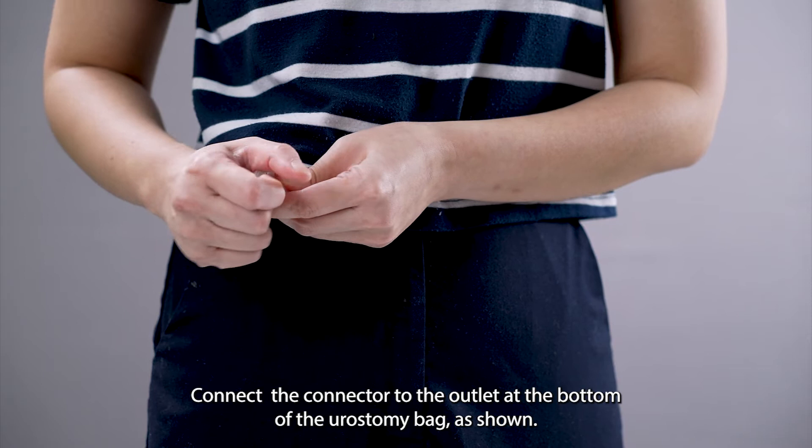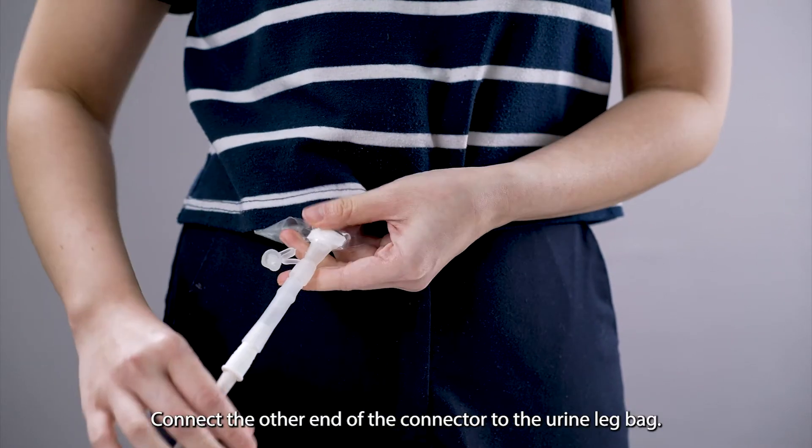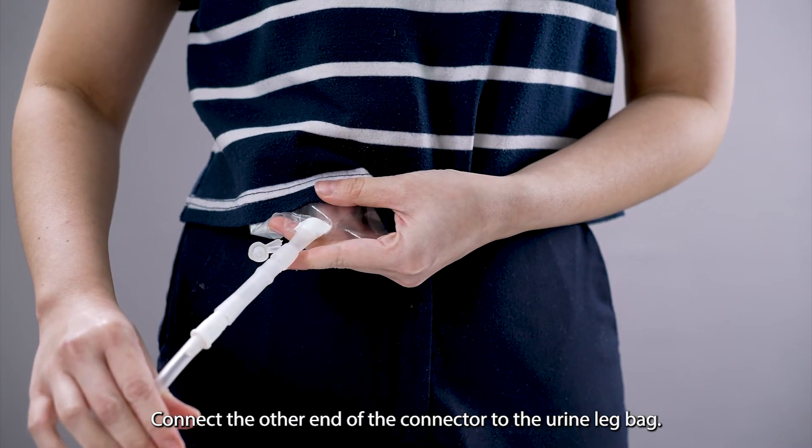Connect the connector to the outlet at the bottom of the urostomy bag as shown. Then connect the other end of the connector to the urine leg bag.